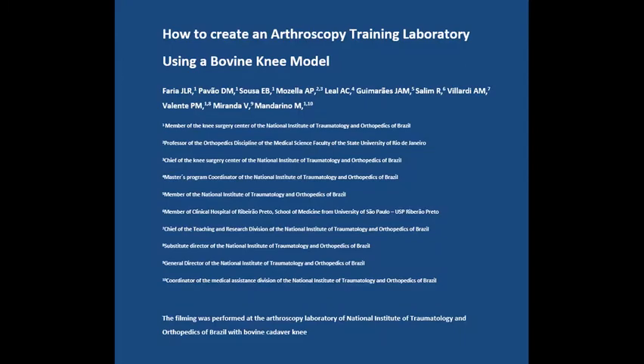How to create an arthroscopy training laboratory using a bovine knee model. The film was performed at the Arthroscopy Laboratory of the National Institute of Traumatology and Orthopedics of Brazil, using a bovine cadaver knee.